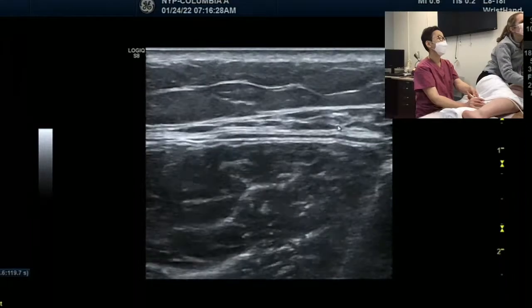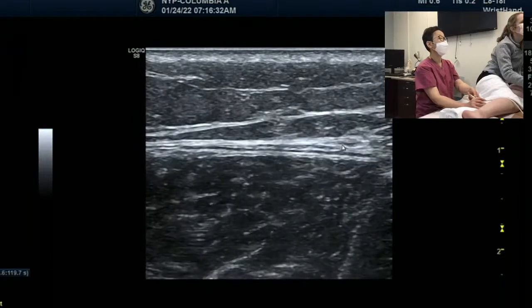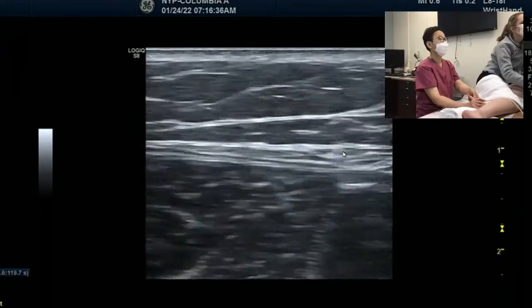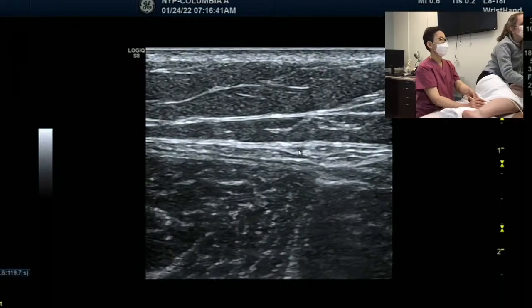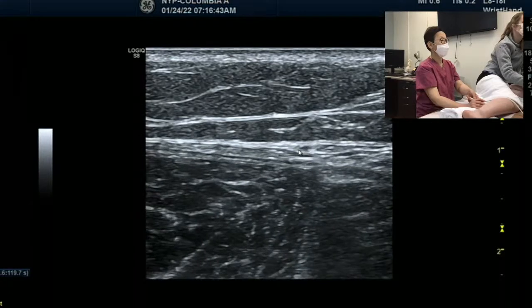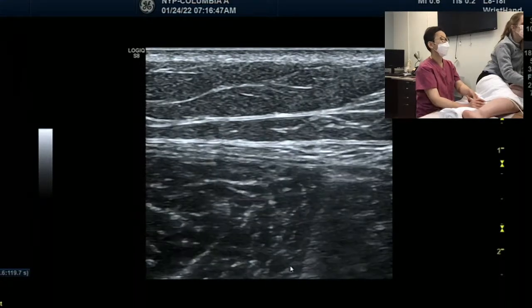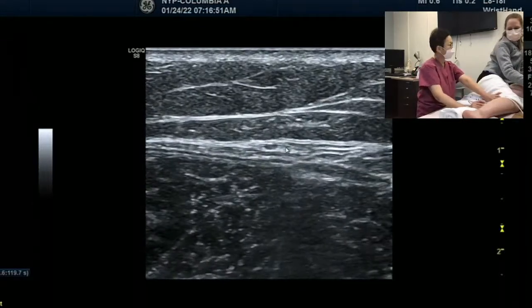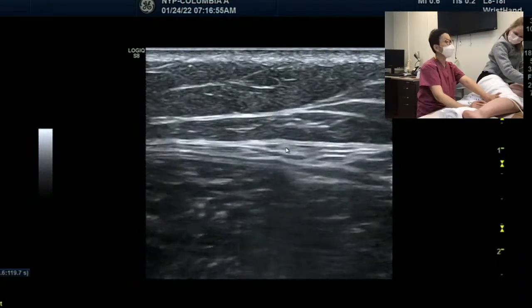If I go up over here, it's going more close to the muscle. Now it becomes flatter and splitting in two. Now it's clearly two, right? One, two. Look at where the fascia line is between the medial head and lateral head of the gastrocnemius. That's it, right? So it's exactly where we are, which is almost two fifths from the ankle to the proximal, or close to the middle.